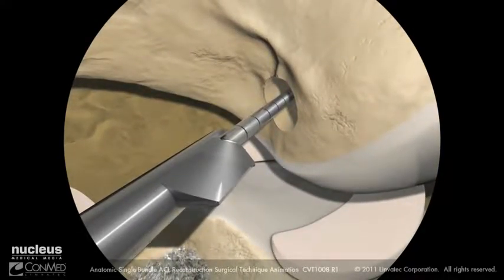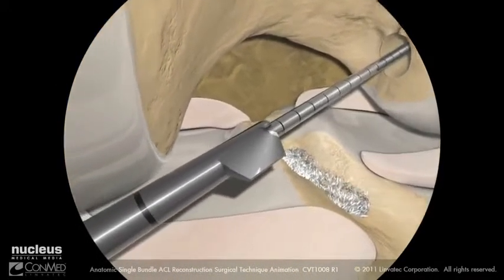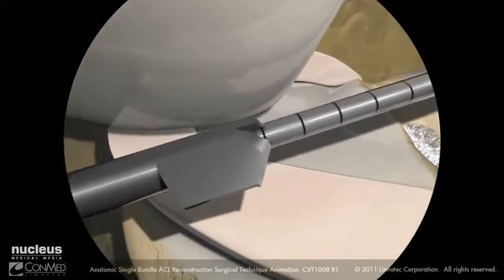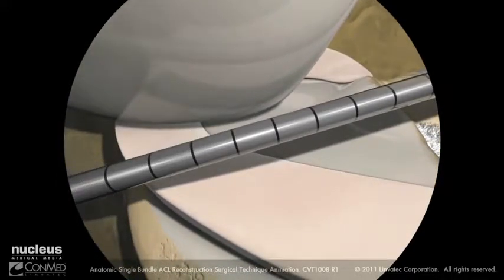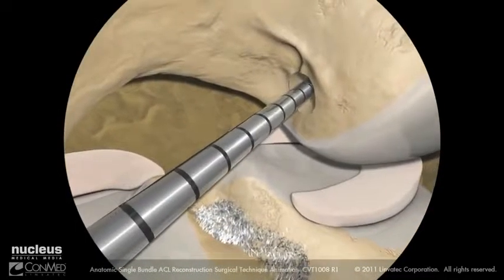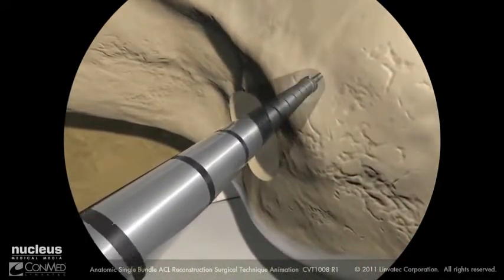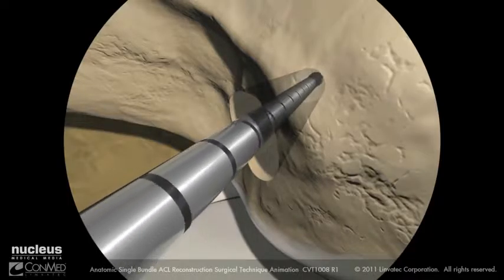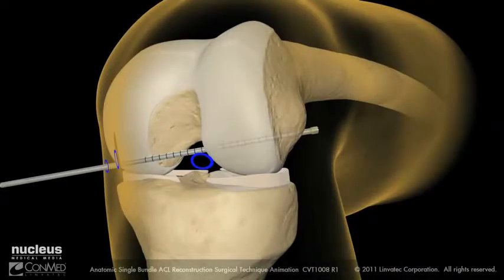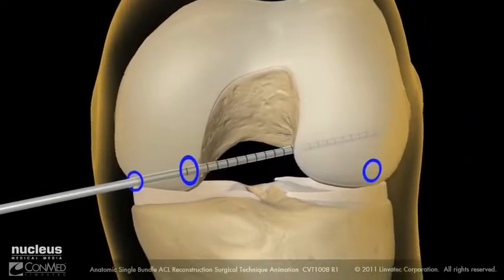Keeping the hand off the trigger, slide the sentinel drill bit past the medial femoral condyle and out of the portal, making sure to keep the blade oriented away from the condylar surface. Using the XO button drill bit to drill the femoral channel, advance the drill bit through the lateral cortex. Using the XO button drill bit as you would use a standard depth gauge, manually pull back on the bit to hook the head of the drill bit on the external femoral cortex to confirm the aperture to cortex length.